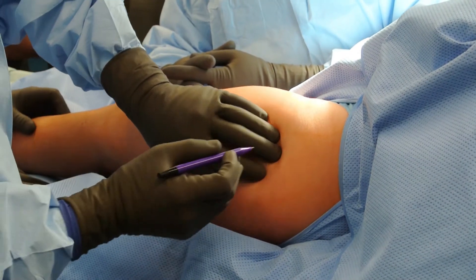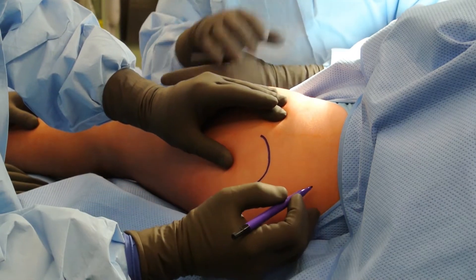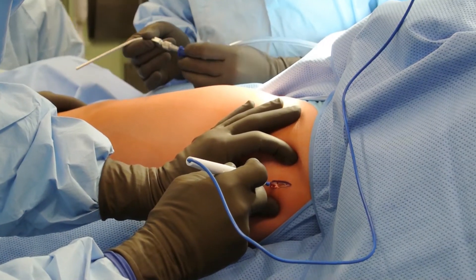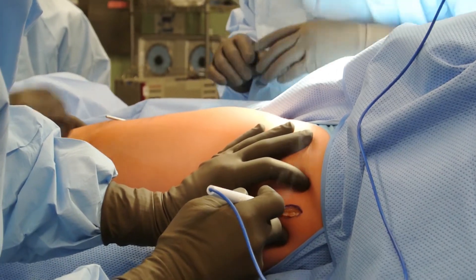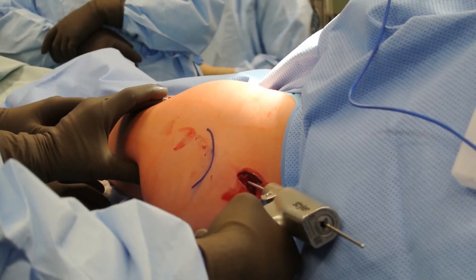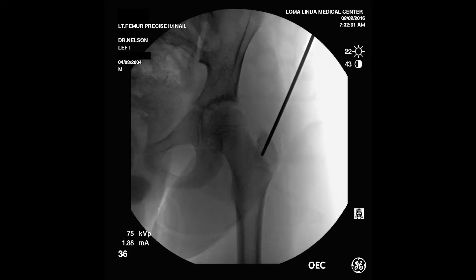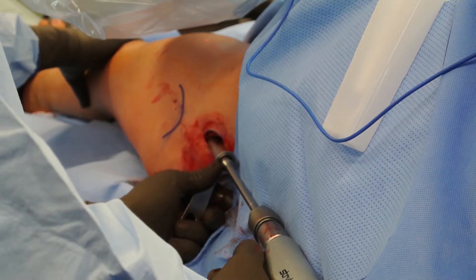The bony landmarks are palpated, the greater trochanter is marked, and an entry point in the skin approximately 5 cm proximal to this is established. It is not necessary to make the entry incision more than about 2 to 3 cm in length for most cases. The dissection is carried down to the greater trochanter, and a guide pin is placed into the tip of the trochanter. In this patient, we are planning to use a 10.7 mm diameter nail, and thus a 13 mm entry reamer is used.